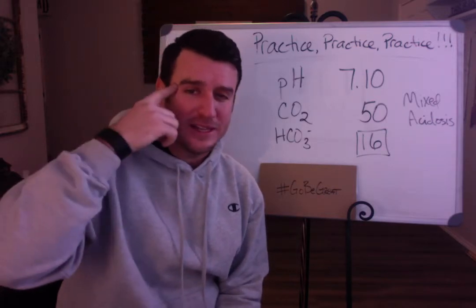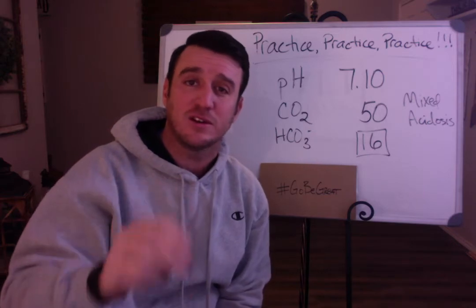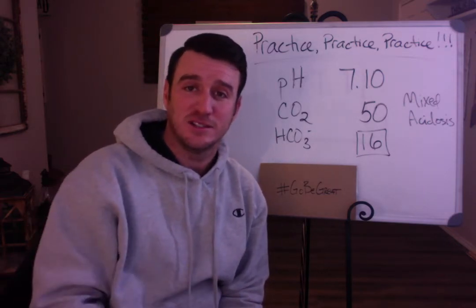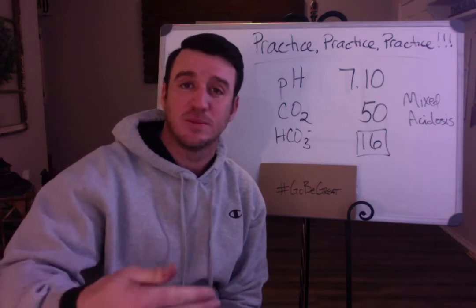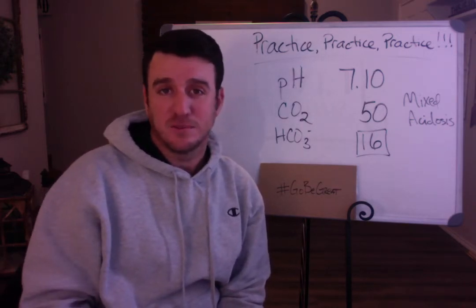So you got to be able to think like this. If you can take two values off of any arterial blood gas and interpret them correctly, then congratulations. You've won. You're the champion. You've developed a skill into interpreting arterial blood gases that is well beyond the average person.